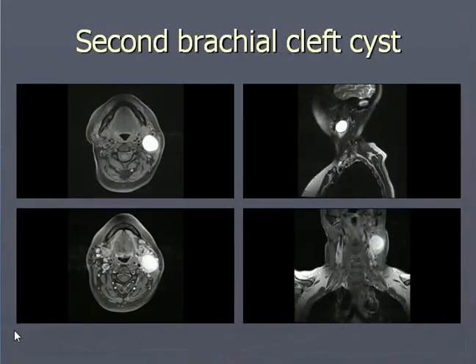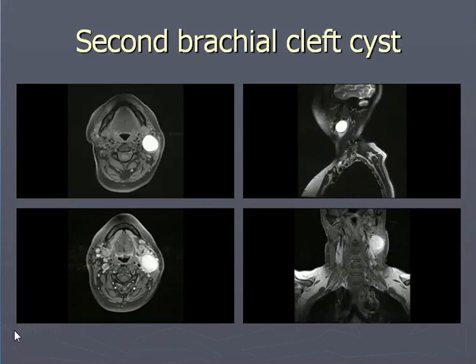This is the case of a second branchial cleft cyst. You can see the T1 and T2 weighted images — these are mostly T2 weighted images where you can see a bright or hyperintense, well-defined, rounded lesion in the left side of the neck.